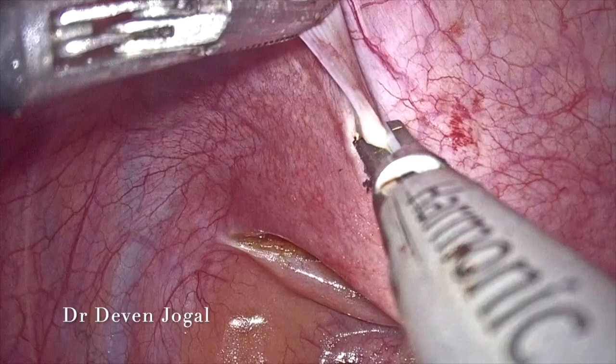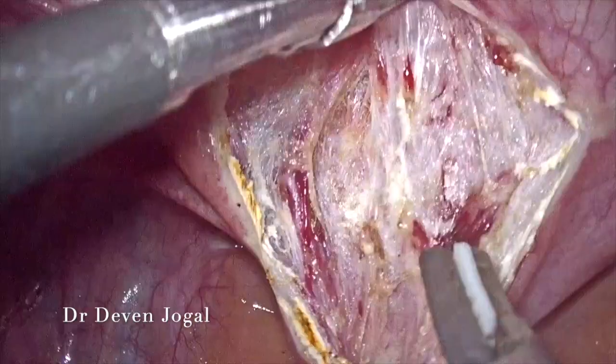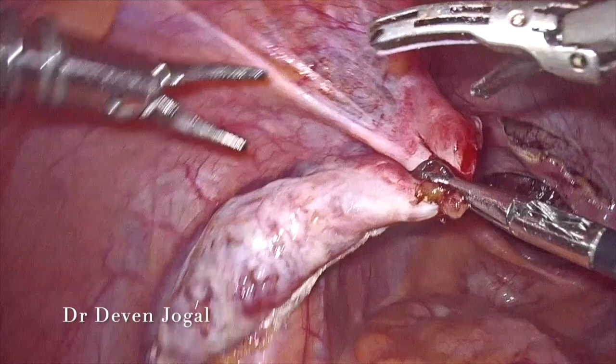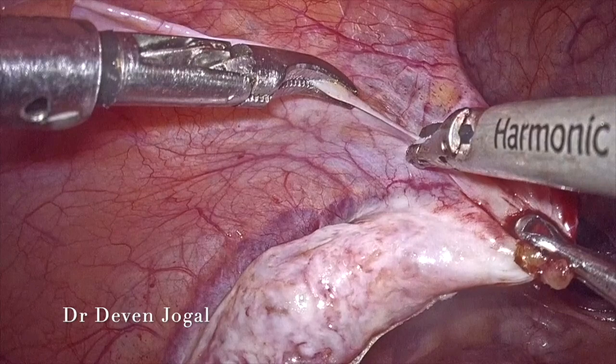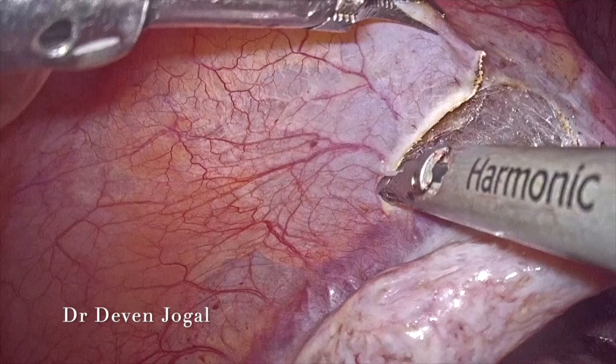Similarly, dissection was carried out anteriorly. The vesicovaginal fold was opened and the bladder was pushed down. The difficulty we face here compared to a normal patient is that whatever advantage we get with the help of the cervix while pushing the vesicovaginal fold, we do not get that here.